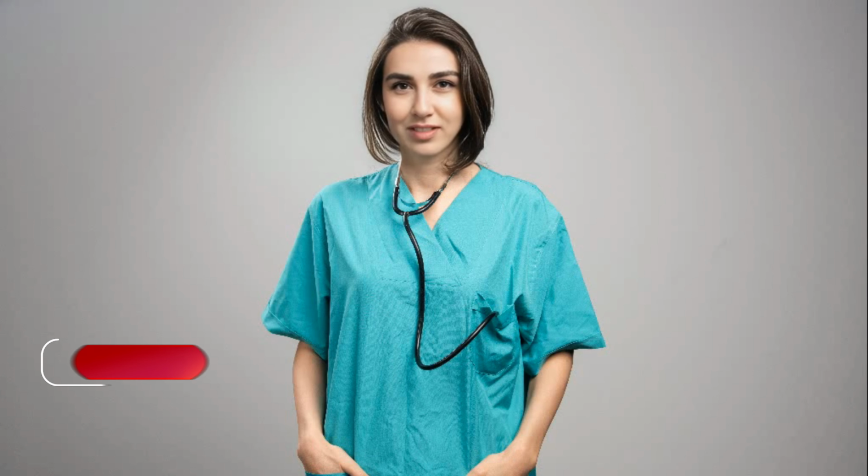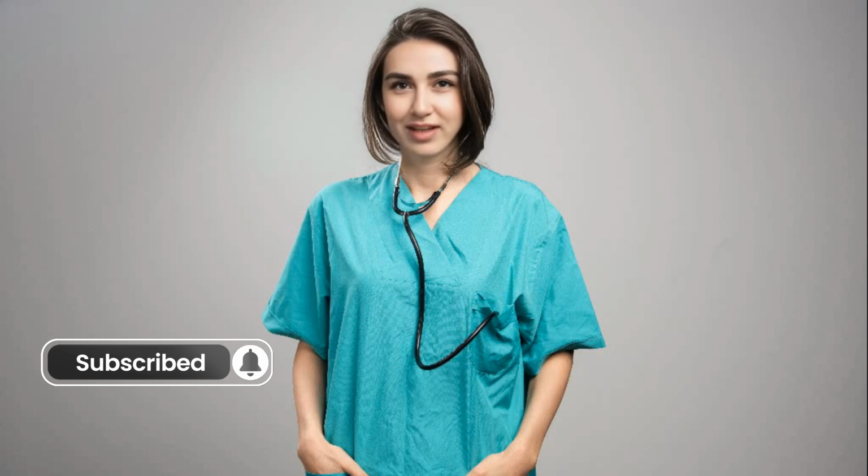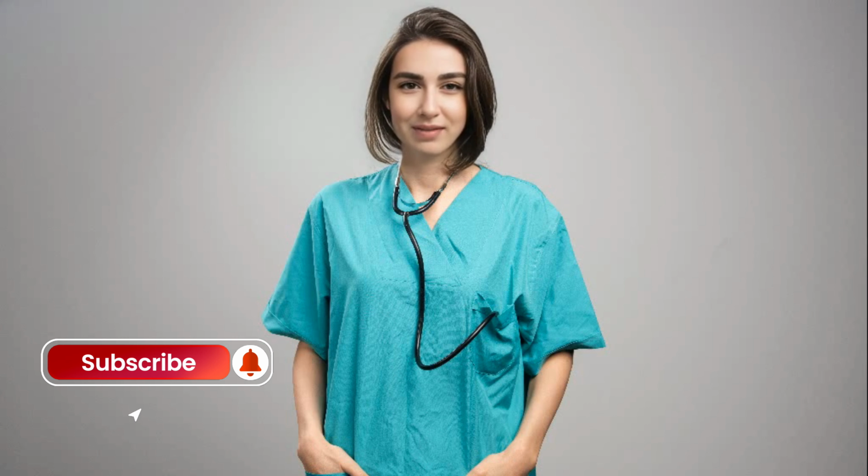4. Sudden heart attack during angioplasty. Though rare, a heart attack can occur if a plaque fragment or blood clot dislodges and blocks an artery during the procedure. If this can't be managed in the cath lab, surgery may be necessary.